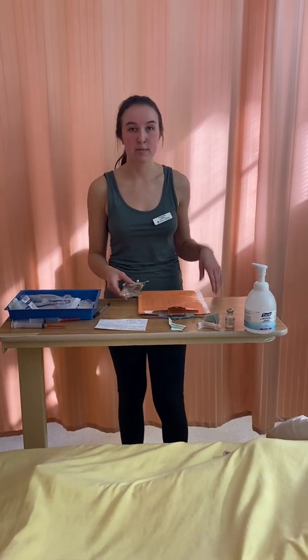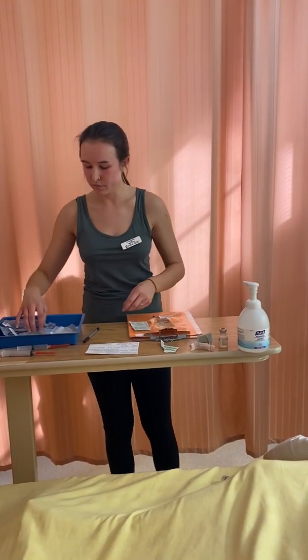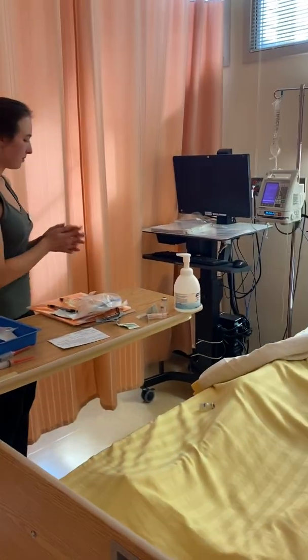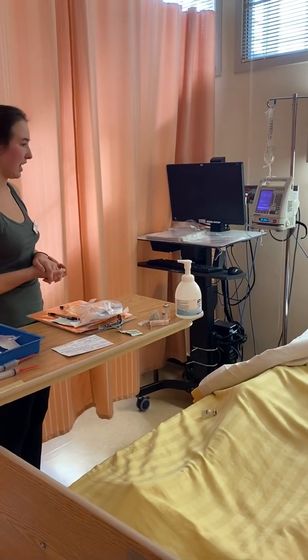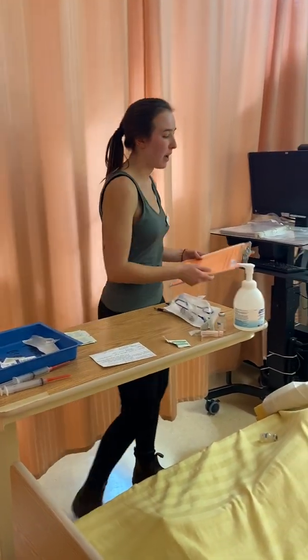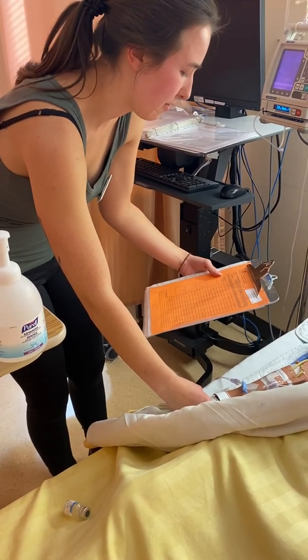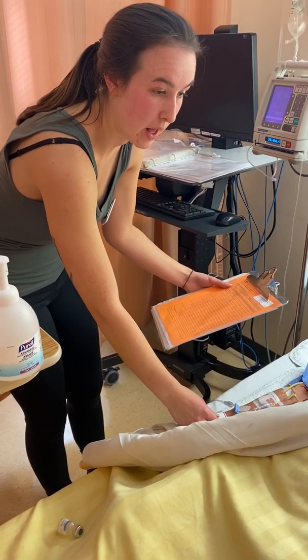I'm now going to collect the items I need before entering my patient's bedside: my medication, my MAR, alcohol swabs, the correct tubing, and my pump. Entering my patient's room, I'm doing an entrance safety check and washing my hands. There's nothing on the floor and my patient is alert and oriented. Hi, my name is Marissa, I'm going to be your student nurse today — I'm here to administer your medication. I'm going to compare my patient's armband to my MAR: right patient, Fiona Friedman; patient identification number 123456789 — confirmed. I'm also noting that my patient has an allergy to morphine, which I should have noted earlier while preparing my medication.